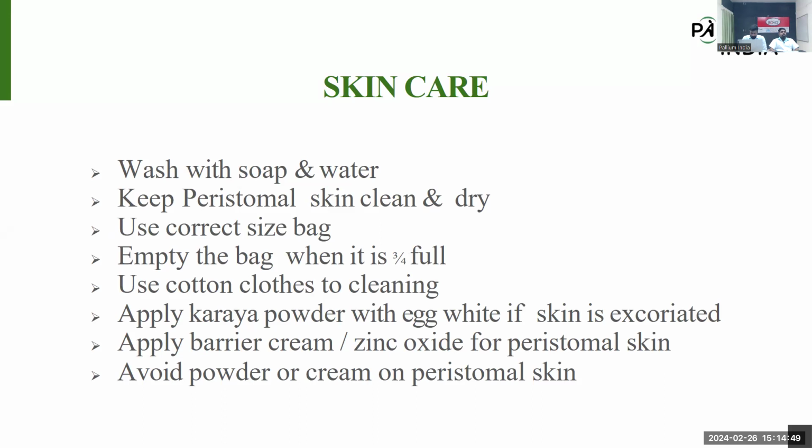Use the correct size of bag. That's very important. The peristomal region should be minimally exposed by the bag. Otherwise, if the area is exposed, it will come in contact with the secretion or fecal matter from the stoma colostomy site. So use the correct size of bag.